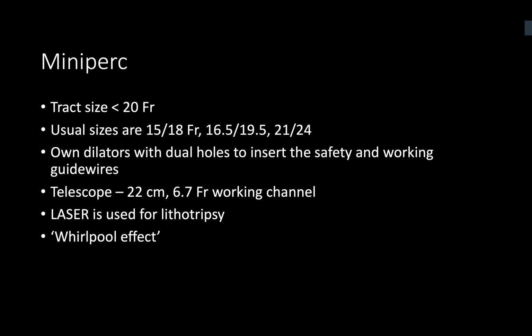Do you use Miniperc in your practice? So I've not used it in my practice personally, but I am aware that it is increasing in popularity nowadays due to the smaller tract size used, and the theoretically perceived lesser risk of complications with the smaller tract size, such as bleeding and injury to adjacent structures. Okay. Yeah, exactly. So it is gaining in popularity. There is no clear definition of the tract size between a standard PCNL and a Miniperc, but it is accepted that anything less than 20 French can be called a Miniperc.